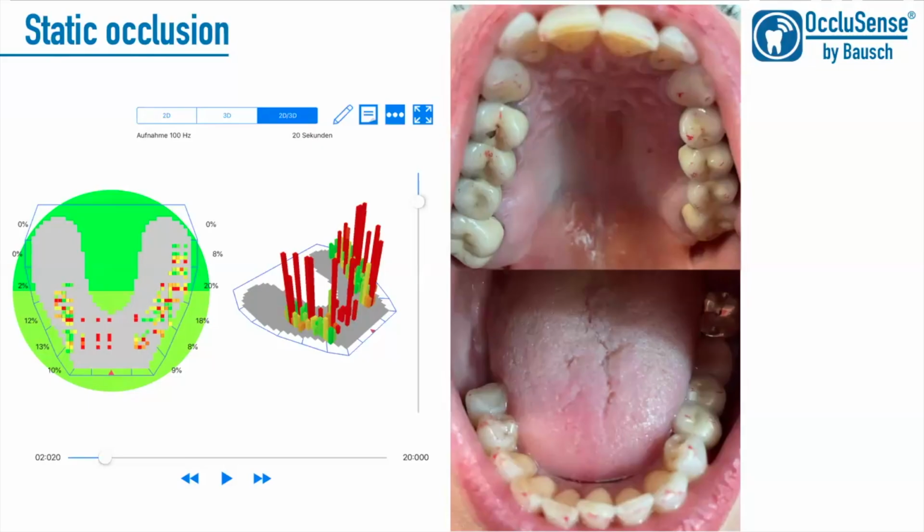prosthodontics being done, it's actually quite important to try and ensure that her occlusion is roughly evened out. As you can imagine, some of these restorations are on unvital teeth, and their tactile sensitivity is not the same as the one on vital teeth.